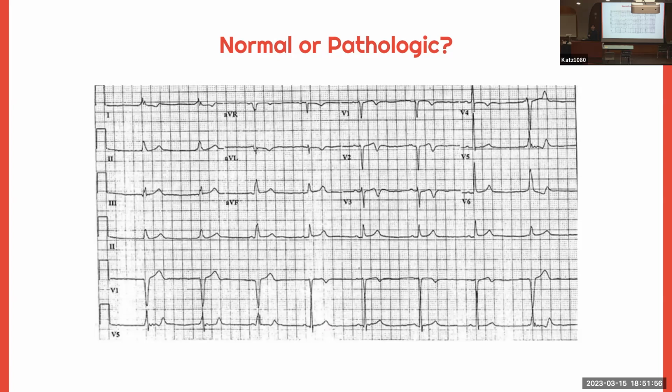So there are general guidelines. Let's say if an interval is wider than however many blocks on the square, but what happens if it's right on the border? We don't really know what to do.